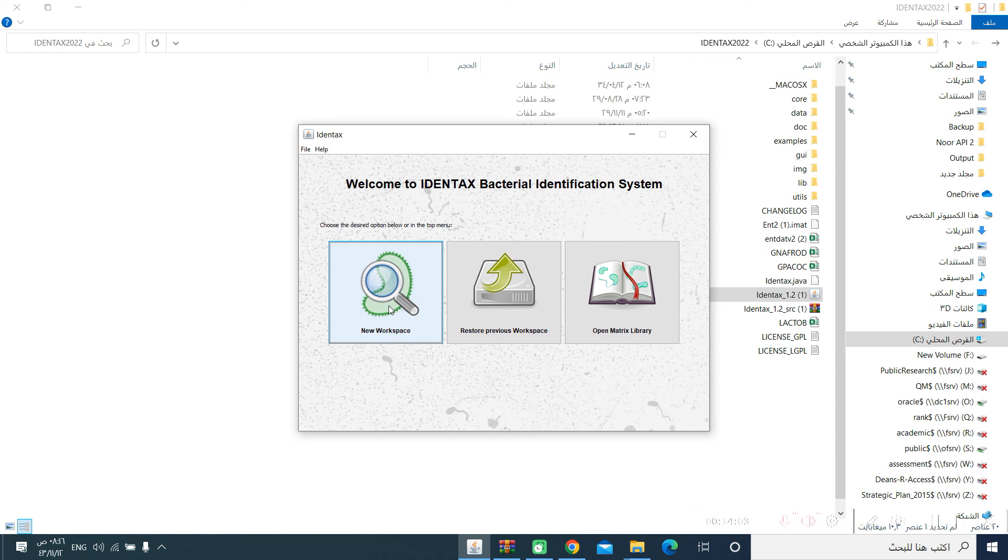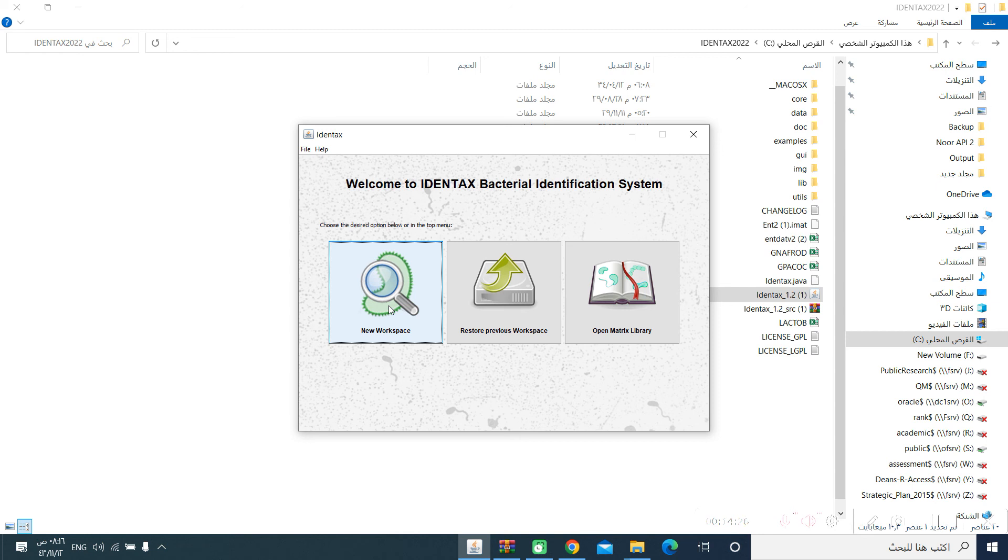This is the way how IDENTEX's bacterial identification system works. It is, as I said, very easy. You can make your own matrix in an Excel format, and then import it to your software. I mean, customized, based on the availability of the tests in your laboratory. I hope this video was useful to you. Many thanks. Assalamualaikum warahmatullahi wabarakatuh.